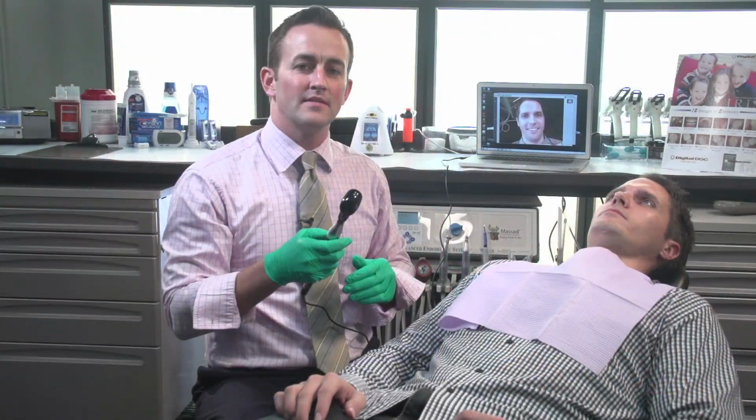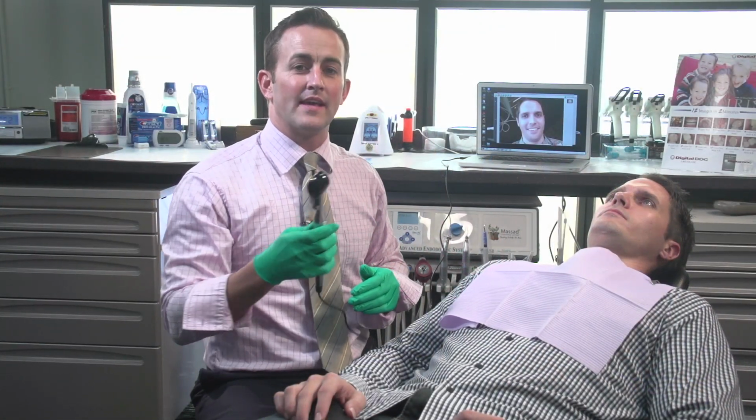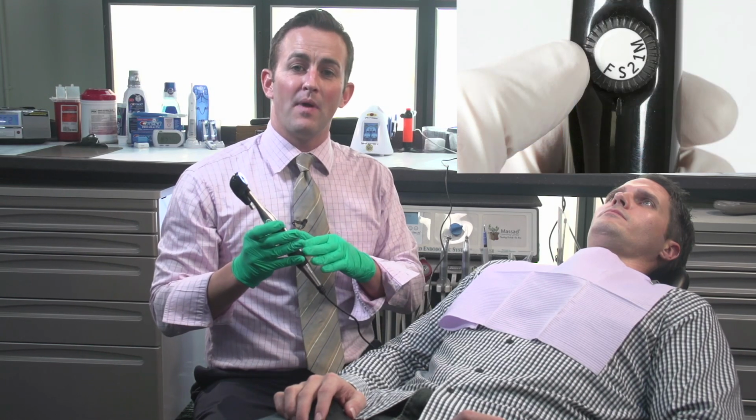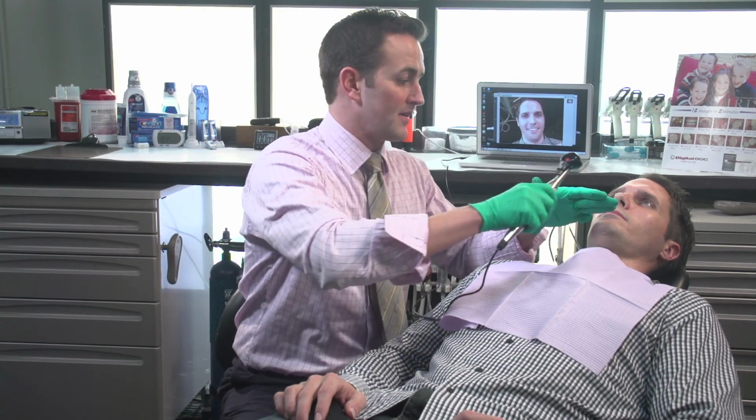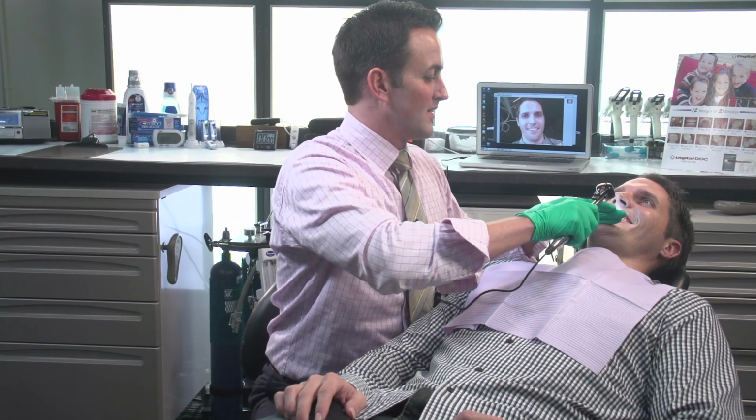Next, we're going to go ahead and place the camera on the S setting for smile and position your opposing hand 3 to 4 fingers off the labiomental groove of your patient. Smile for me.